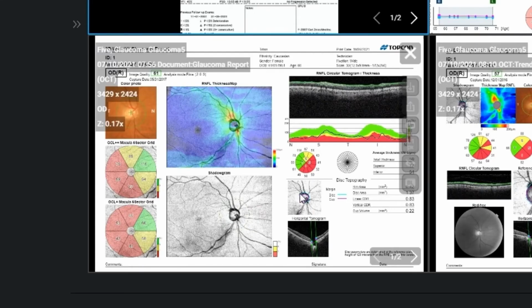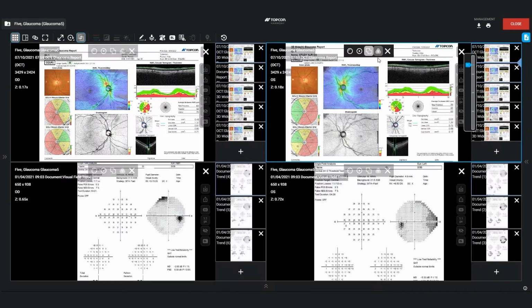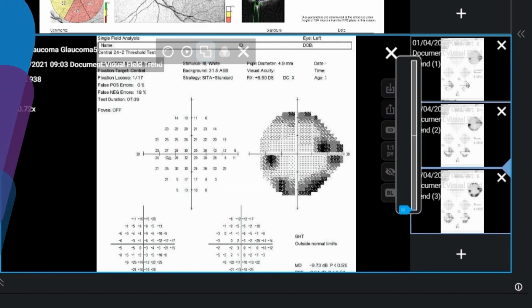Single-visit OCT reports are also provided for each eye individually, and an OU report enables symmetry analysis. A dynamic fly-through option allows visual inspection of the patterns of change associated with the changes seen in the glaucoma progression clinical view. All of the glaucoma views may be customized to streamline your decision-making.